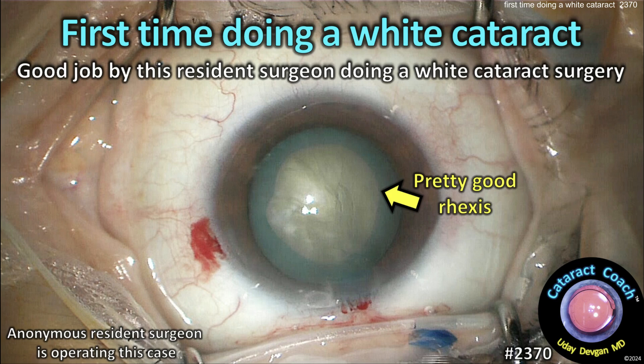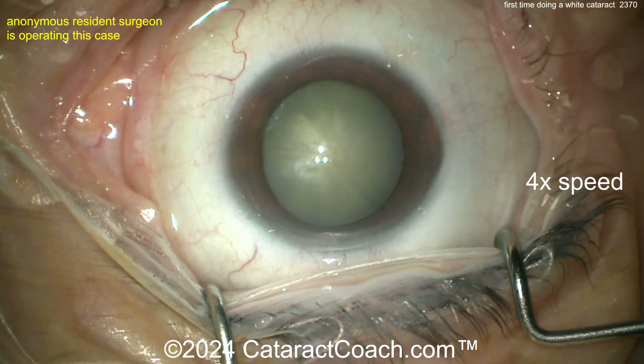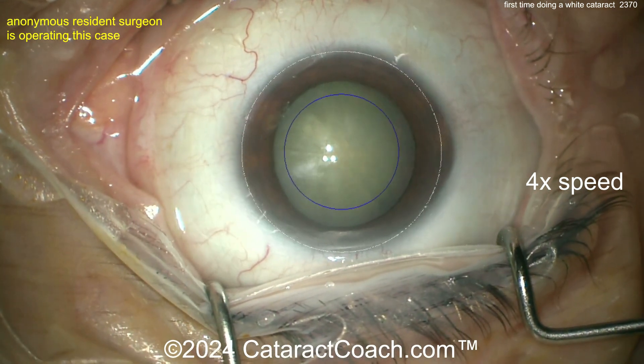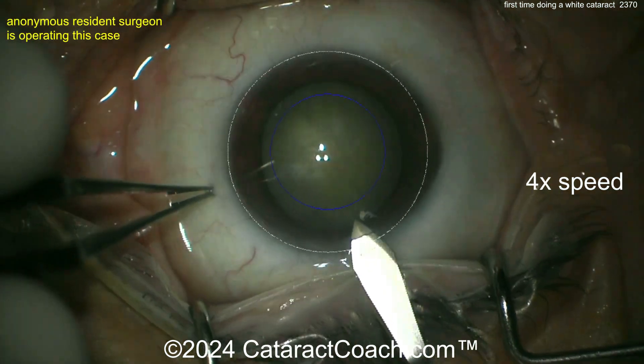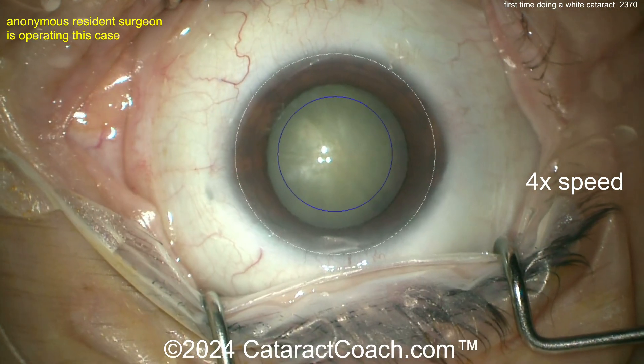CataractCoach.com — the first time doing a white cataract, so good job by this resident surgeon for a tough case. A white cataract can be full of surprises, so for a young resident surgeon we're going to watch the video sped up a little bit to get through the whole thing.